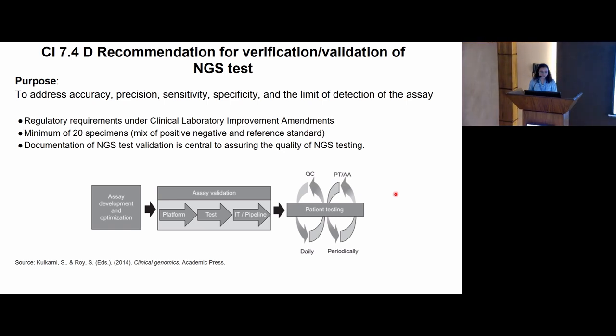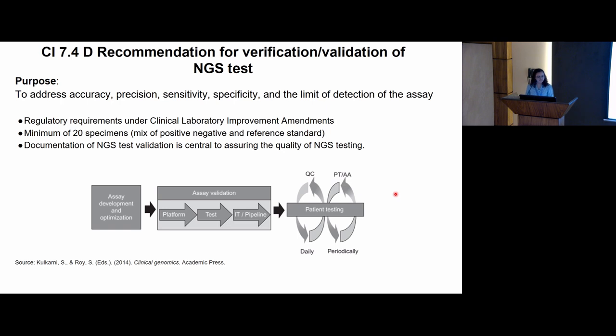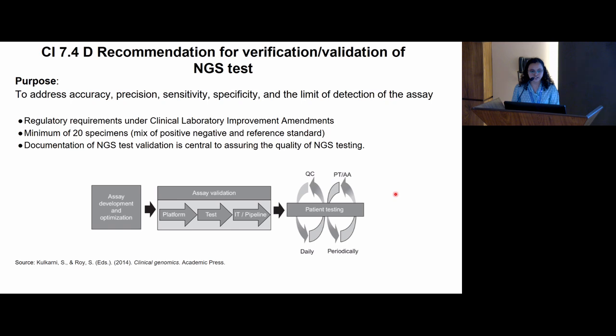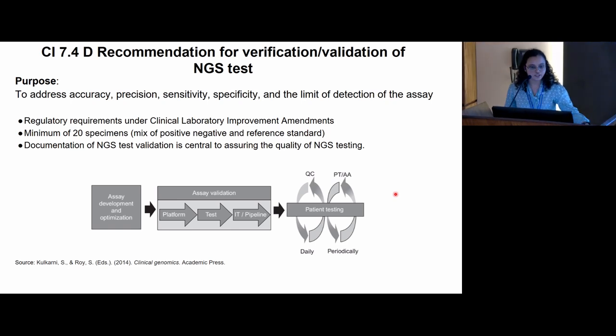Good afternoon all. I am Komal Kumbhalwar and I am a PhD scholar under Dr. Naveen Khatri, Dr. Nikhil Patkar and Dr. Sachin Punatar. In the next few slides I am going to share a glimpse of the recommendations for verification and validation of NGS tests.